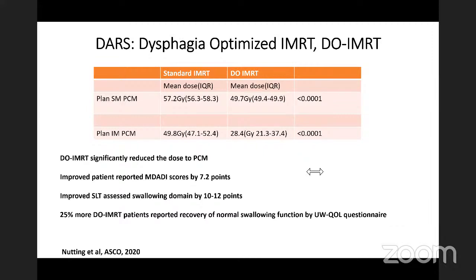Sorry. Go ahead. Sir, if there is any node which is very close to the skin and in VMAT or IMRT planning, it is difficult to cover the whole node with the proper 95% dose in the PTV. So in those cases, do you prefer adding bolus in there, or you will accept whatever the plan is there?